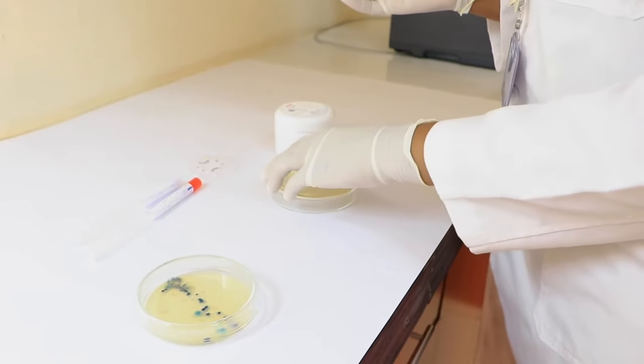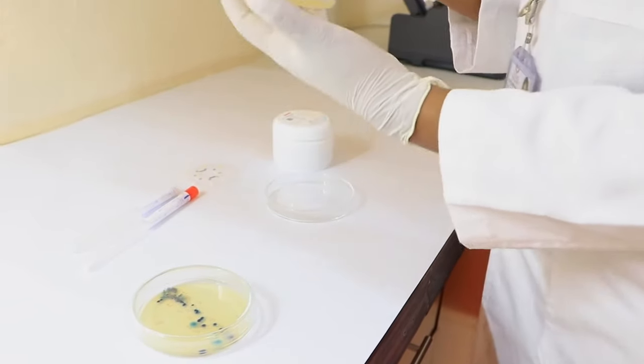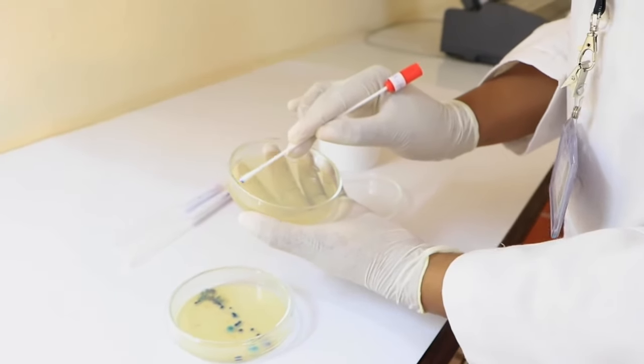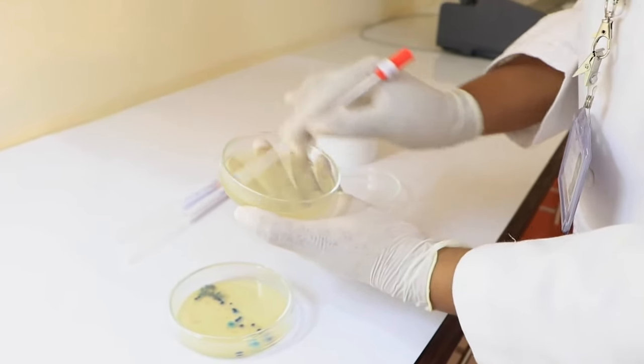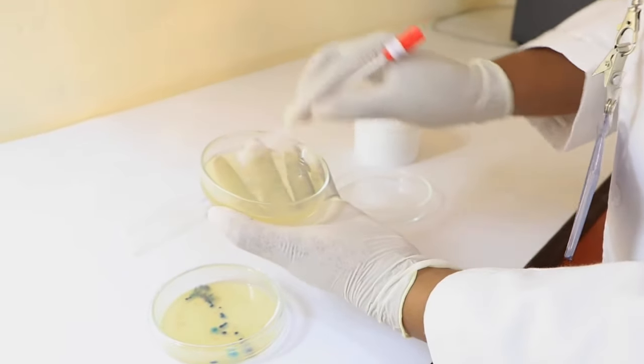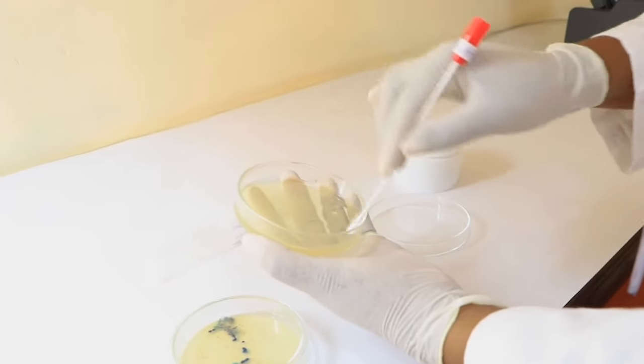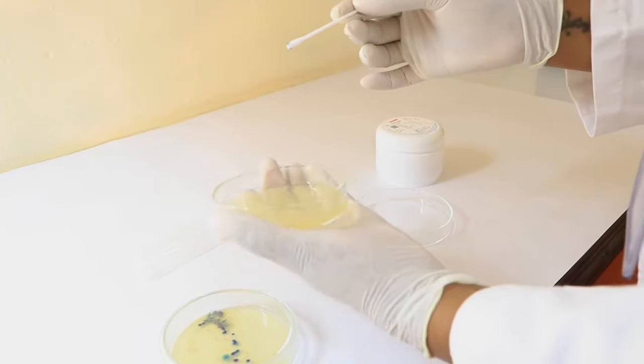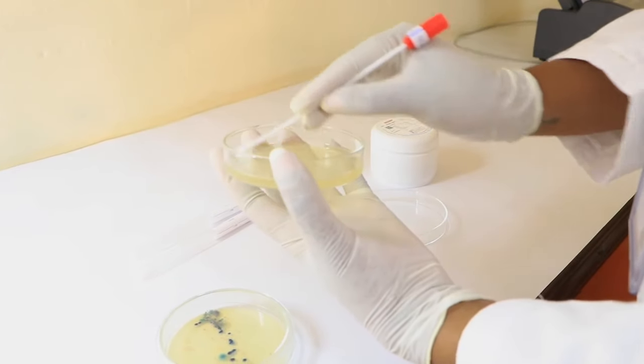Inoculate a lawn on the Mueller Hinton Agar by spreading the bacteria evenly to cover the whole plate. You can spread the bacteria again in the perpendicular direction.